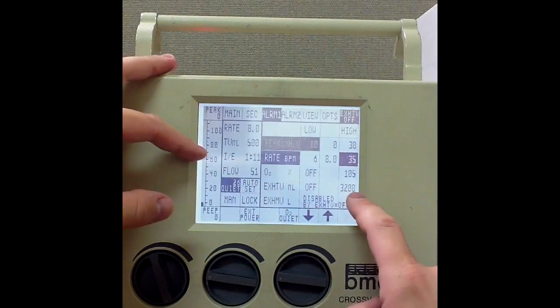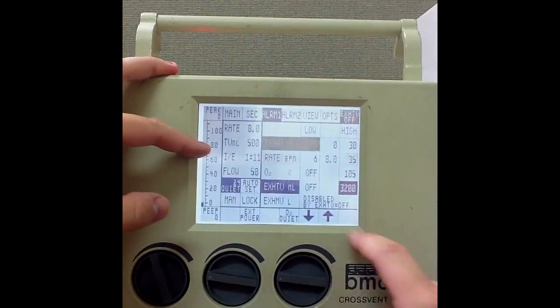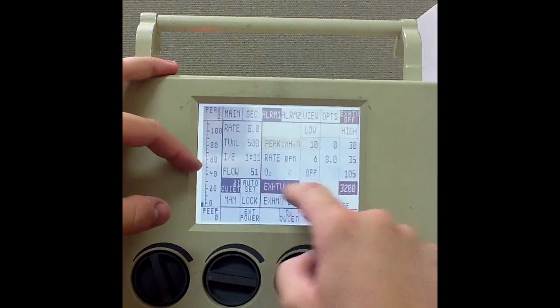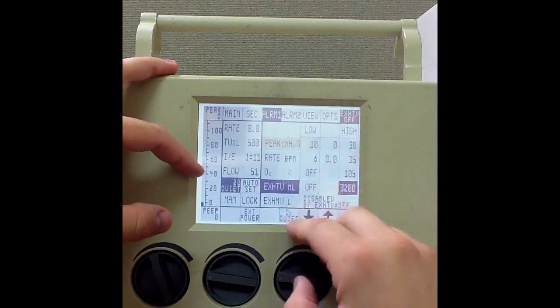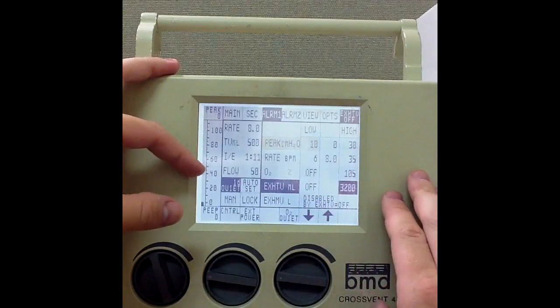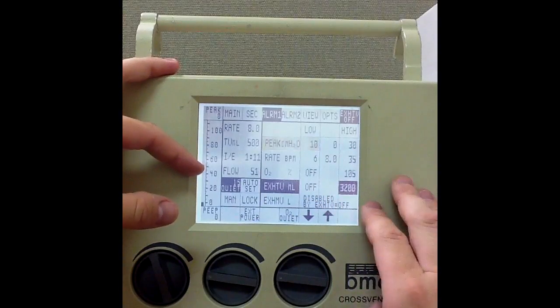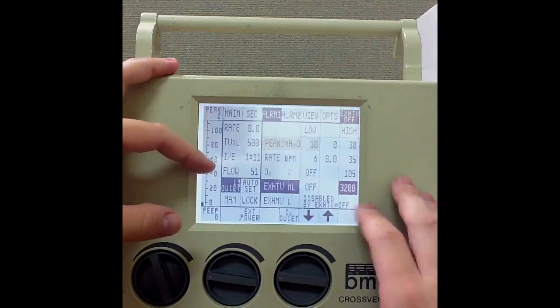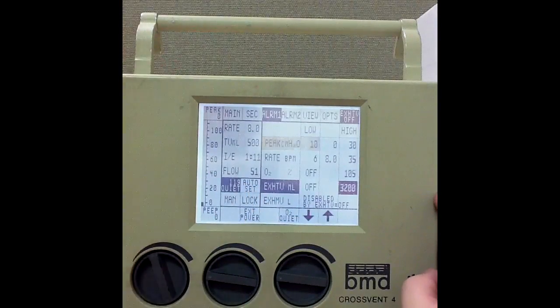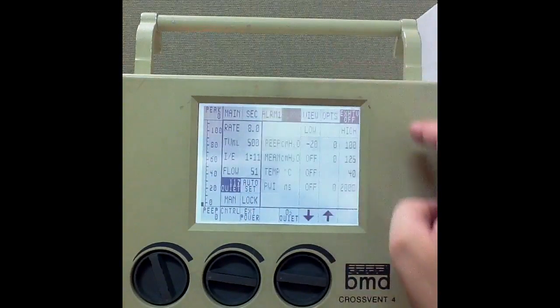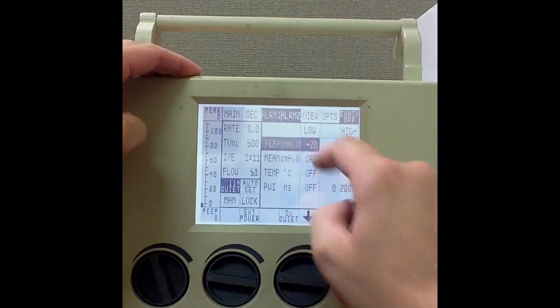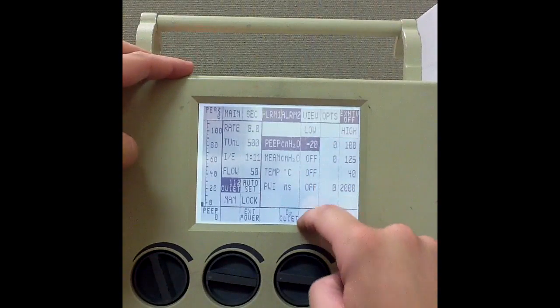Exhaled minute ventilation — it's not going to do anything for me right now because I'm not ventilating, but we set that a liter above and maybe a liter below what our patient is exhaling. We'll give ourselves another two minutes there. Then I'm going to go ahead and go to alarm 2 and set my low and high PEEP. My PEEP is at 5.